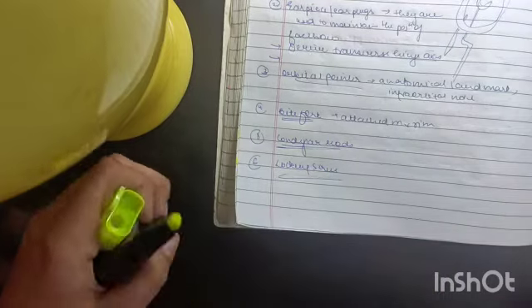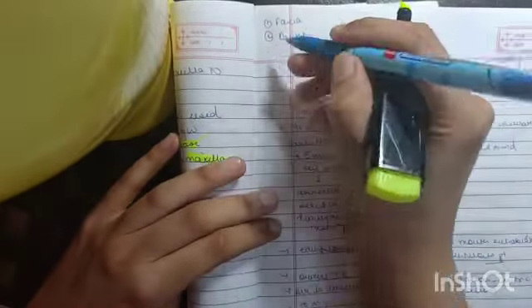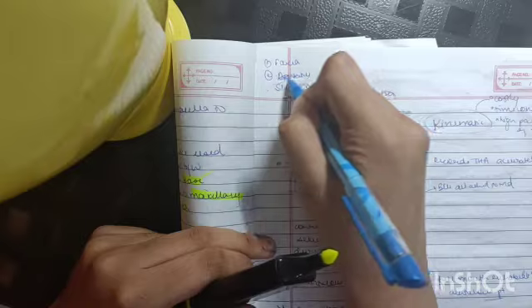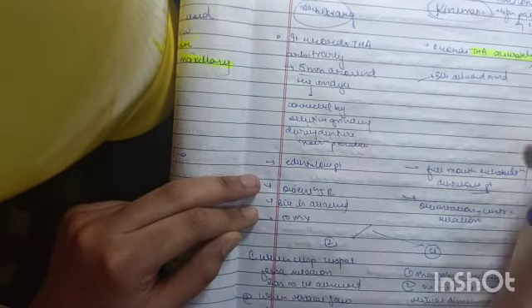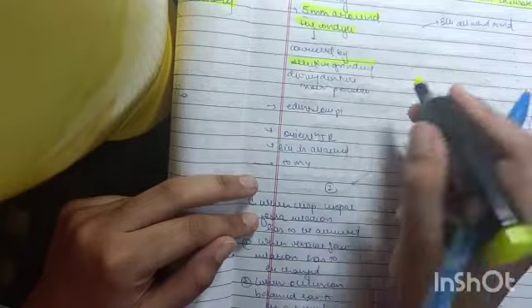All right. Now we will mention the functions of all of the components. There are two types: arbitrary and kinematic. In the examples, you should mention Slidematic face bow. Kinematic will record the transverse hinge axis accurately, but arbitrary will record within 5 mm around the condyle in that periphery, and it is corrected by selective grinding during denture insertion.